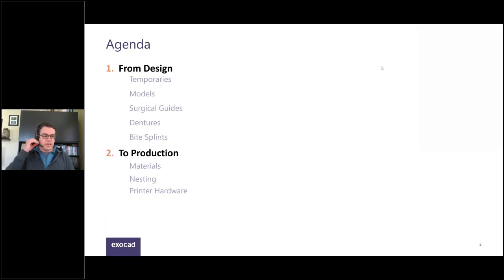All right, thanks, Dave. So for the first segment here, I'm going to go over the design workflows for 5 different product types that lend themselves really well to 3D printing and the printing process, and just show you the highlights and a quick overview of the design process here.